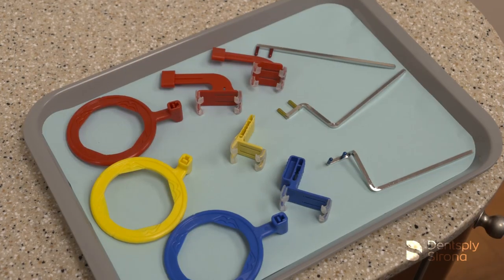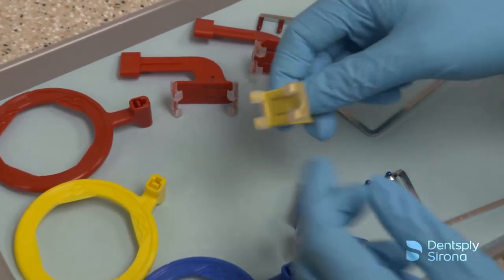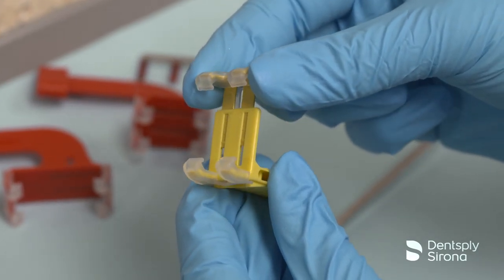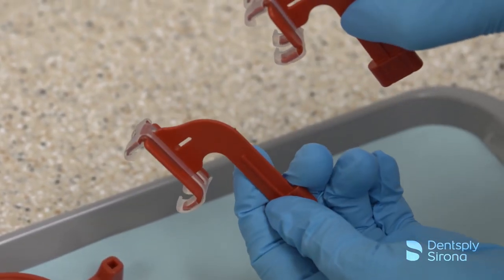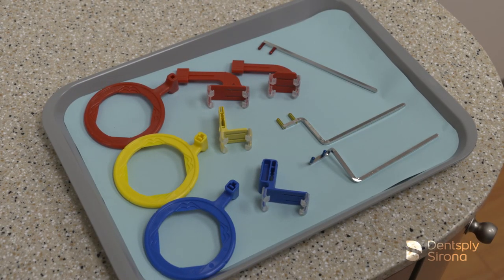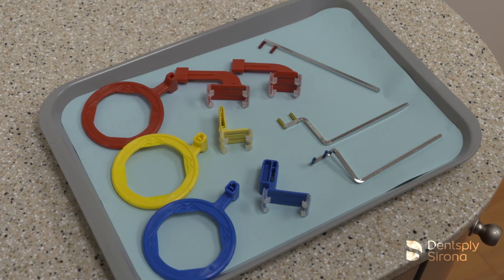The XCP-DS-Fit universal sensor holder has a universal design which provides a custom fit to any size or brand sensor. The self-adjusting clip stretches to fit size 0 to 2 sensors, allowing for less inventory. The holder is autoclavable and has a rigid sensor support which helps to keep the sensor positioned accurately during use. It can be used with the traditional arm and ring sets, which consist of three metal arms and three color-coded rings corresponding to the area they will be used in the mouth.